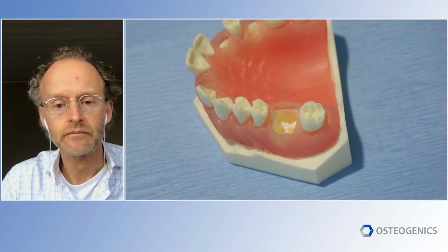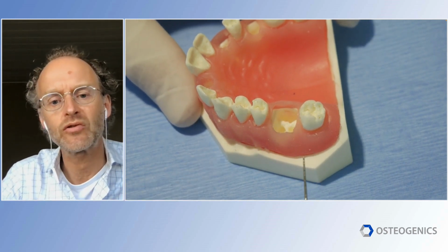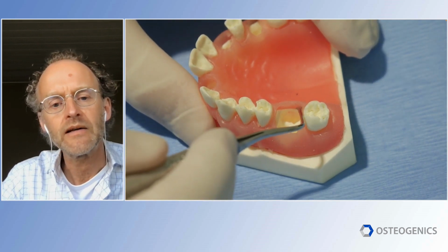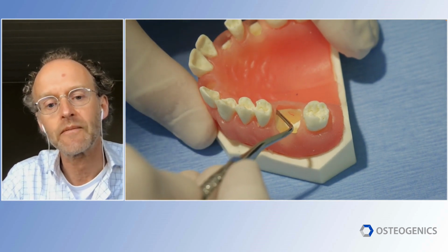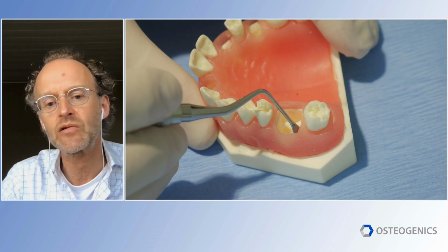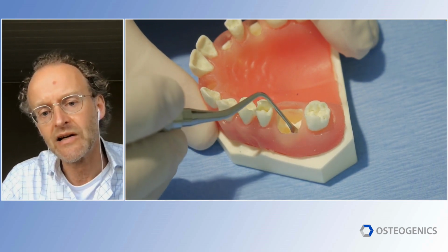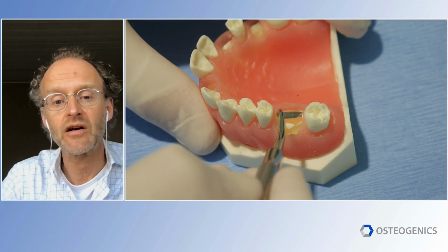Now we go into details. I show you some techniques or just things to look at. First, if we extract the tooth, we want to make sure that all around we have tissue to cover the membrane. Then we can take a surgical spoon, a Lucas spoon, and we start making the envelope, the tunneling. And make sure that you tunnel it very deeply, because then you really have space to place your membrane. Here also, take care that if you make the envelope, also really do use the corners, like seen here. Make enough space for your membrane. And while you're doing this, you can also feel where the bone loss is or not.